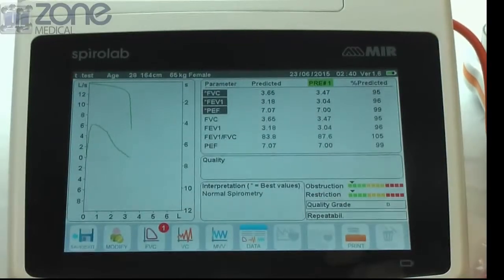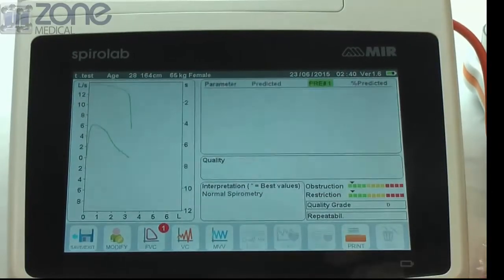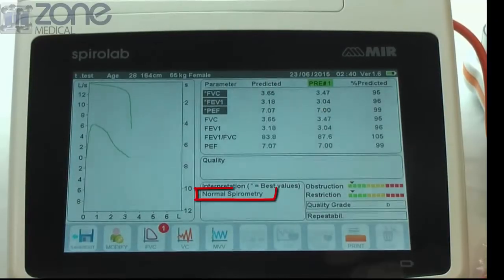You can also view the results by pressing the data tab on the bottom of the page. You will see normal spirometry written on the results if it was an accurate test.